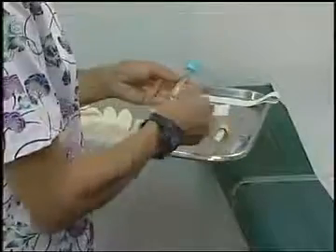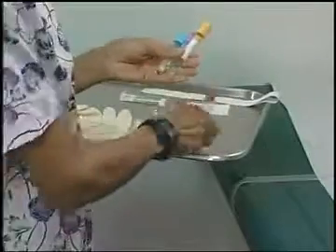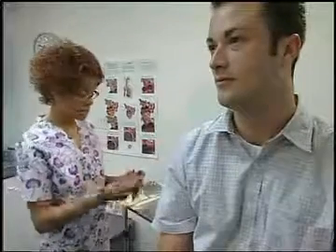We're going to use the vacuum tube method. It's the safest, a totally enclosed system, and the most economical. It's also a favorite because multiple blood samples can be taken in a short period of time from one puncture site. Each of these vacuum tubes has a different colored stopper. Each colored stopper, except the red one, contains a different anticoagulant or additive which keeps the blood from clotting.